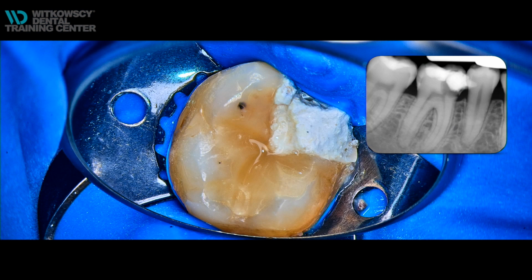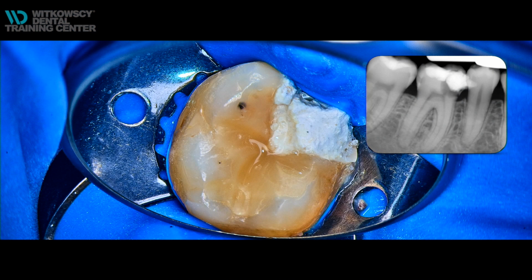The patient came to my office with a regular cavity. He was sent from another doctor, and this doctor wanted me to do an endodontic treatment. And of course, when we look at the X-ray, we see nothing special, just a regular lower molar. But it is a problem.